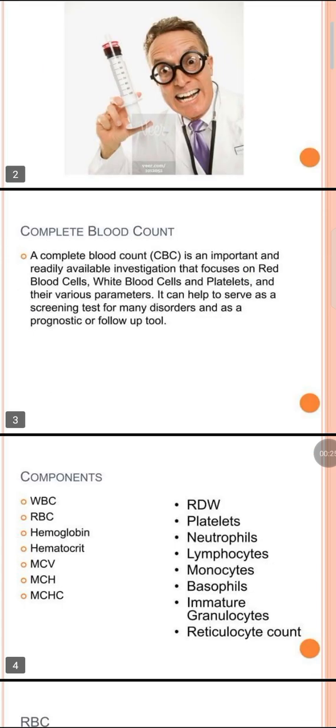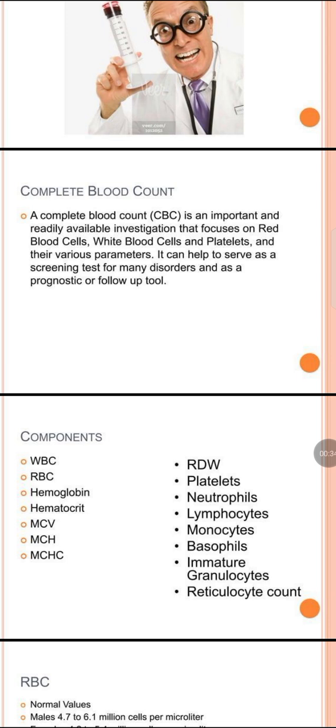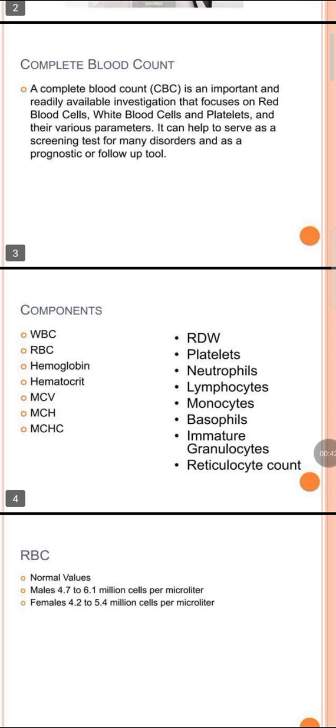It can serve as a screening test for many disorders and as a prognostic or follow-up tool. These are the components of the hemogram or the complete blood count.